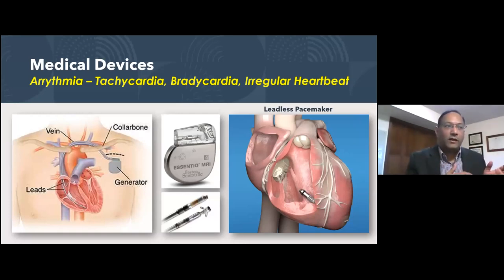So what's happening in the medical industry these days is the making of leadless pacemakers. Leads are going away. You're taking this whole generator, packaging it into a small device like this, inserting it right into the heart, and anchoring it right at the tip of the heart. And this can go on forever.